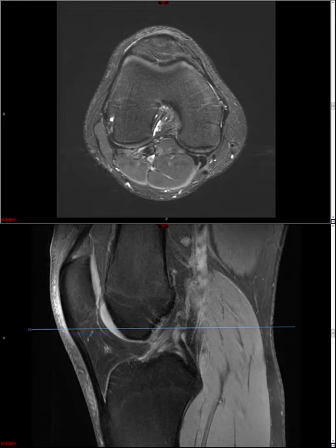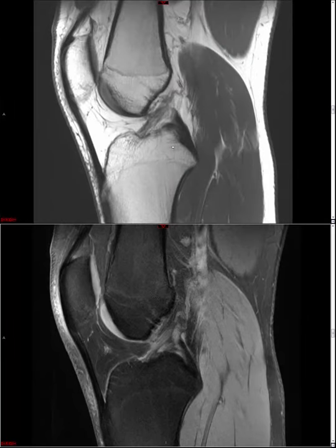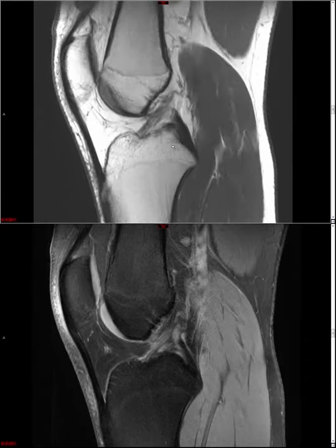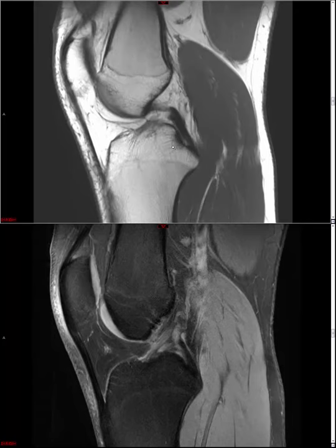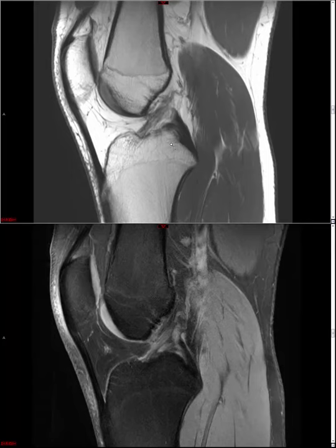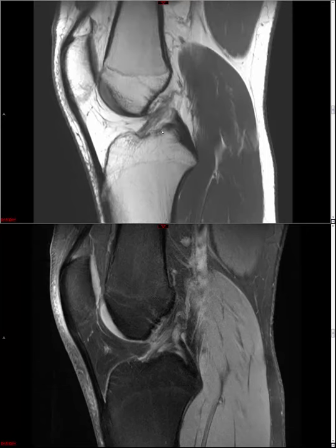So I think a lot of people like to start looking at the ACL with the sagittal, and I do too. The ACL course, I suppose, and the alignment are best assessed on the sagittal sequence. But I think that's all it's good for. It gives you a good idea of the alignment, but you'll have to get used to seeing increased signal in the ACL and recognizing that as a normal situation. So the normal alignment of the ACL should be that the ligament is either parallel to the roof of the intercondylar notch, or Blumensaat line, or it can be slightly more vertical. But if it's more horizontal, then that is worrisome for a tear.